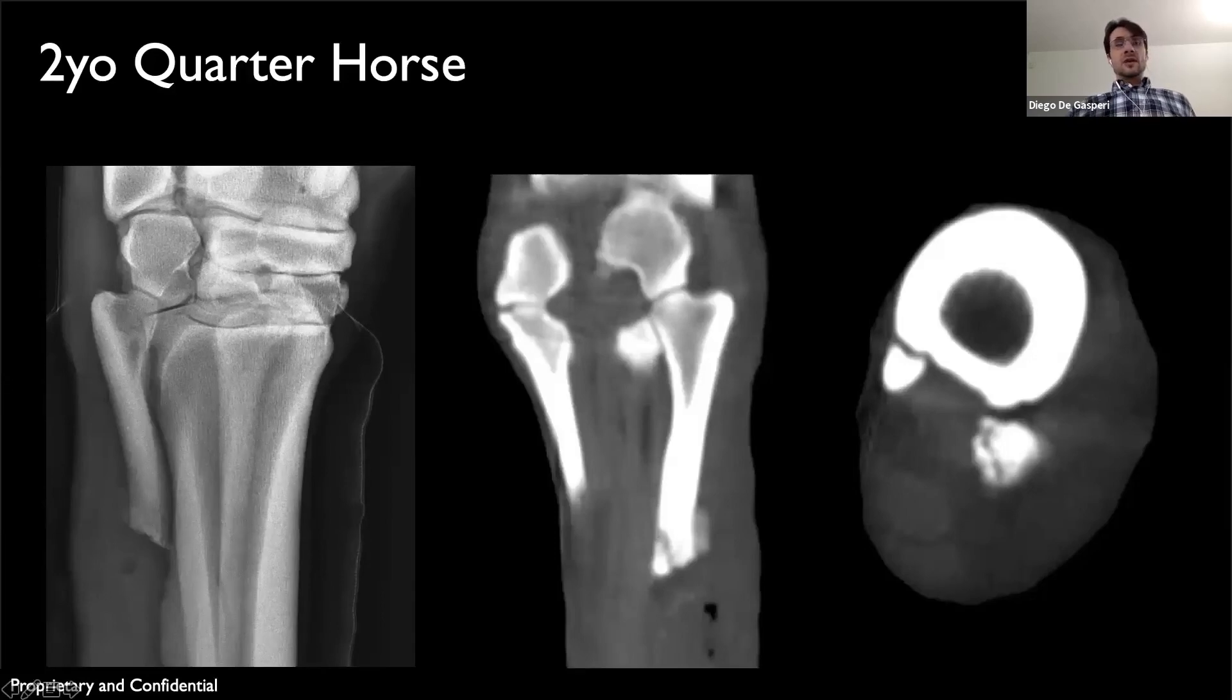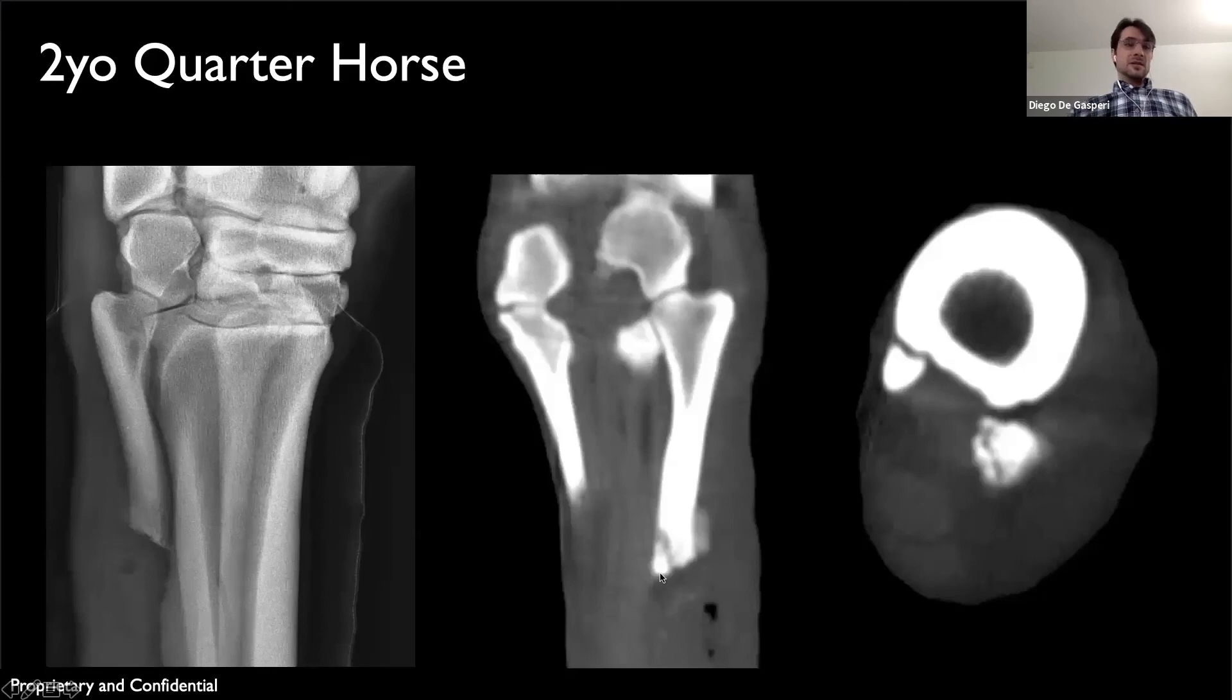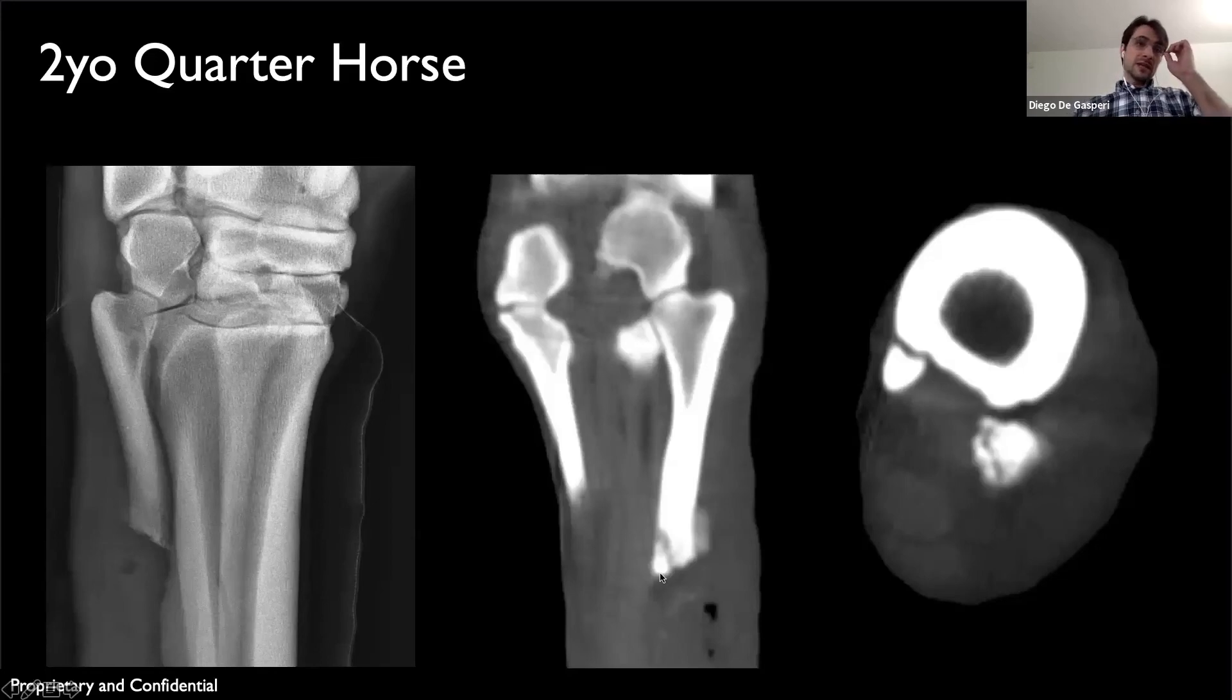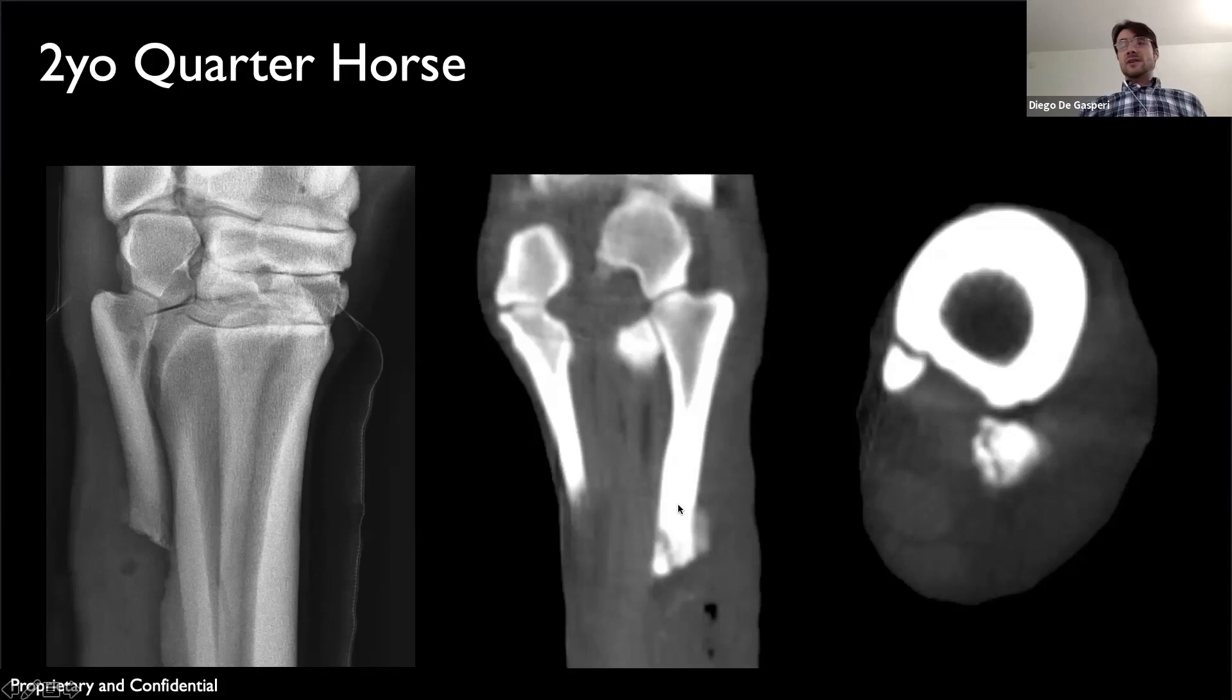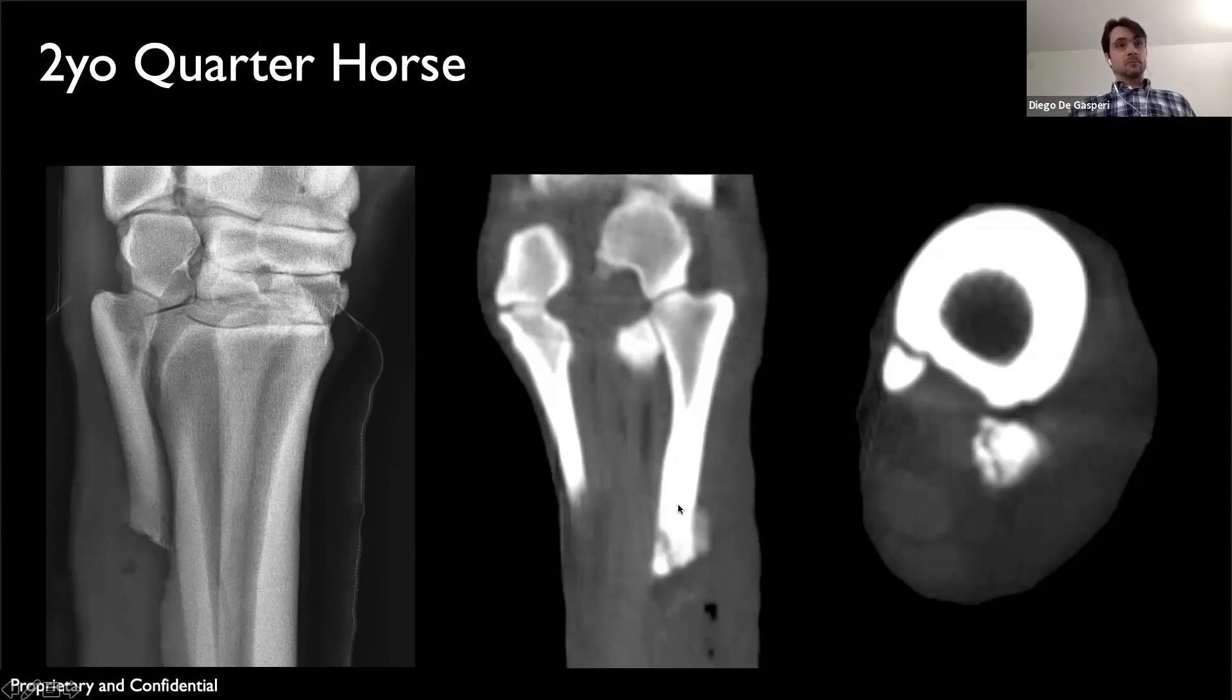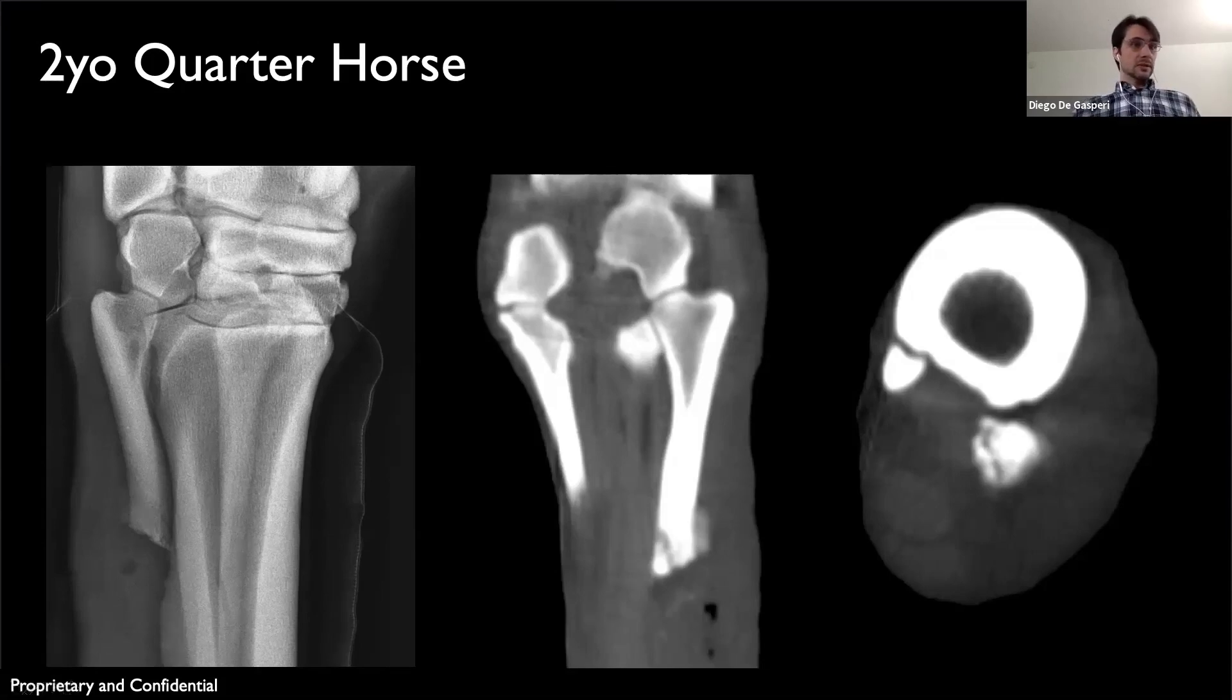We removed that fragment standing. Once that fragment was removed and the area was debrided—you can see some gas-attenuated areas in here—the horse did very well and the wound healed just fine.